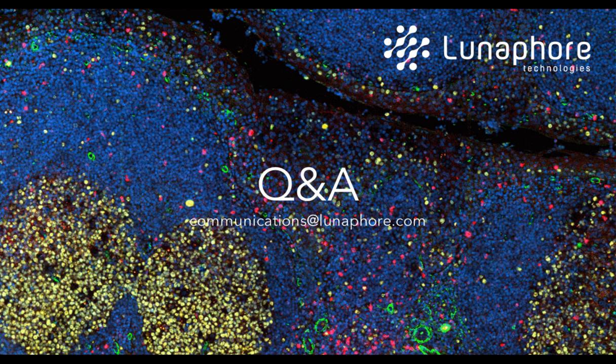Does repeating the elution process hamper the markers to be stained at the end? Yeah, this is a very important point. This is the reason why when we do the optimization for every single marker, we do it on a monoplex basis, but we do what we call elution efficiency and epitope stability studies.